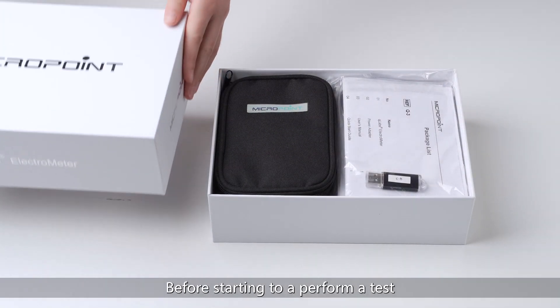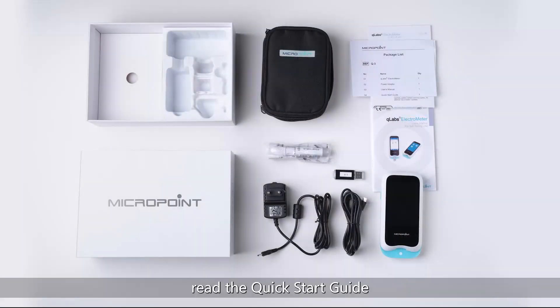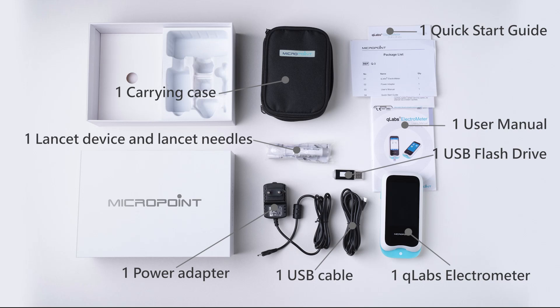Before starting to perform a test, review the components in the Q-Labs package and read the Quick Start Guide and the User Manual. The package contains one Q-Labs Electrometer, one Power Adapter, one USB Cable, one User Manual, one Quick Start Guide, one USB Flash Drive, and one Carrying Case.